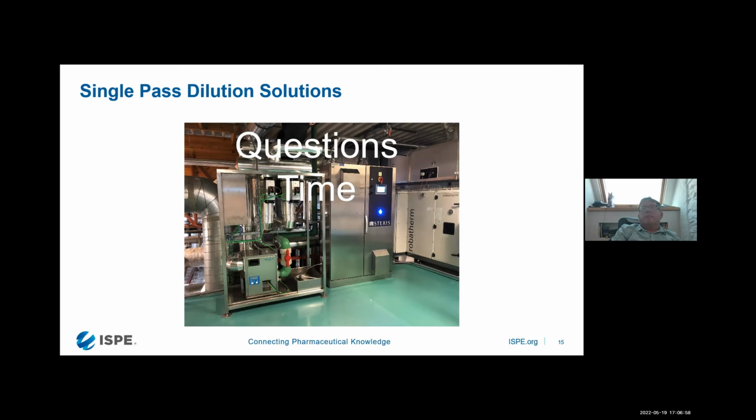Is there any chance that the H2O2 absorbed by the HEPA filter cannot be removed? No, well, the answer is a double no. The first no is that the H2O2 has, let's say, a short life. The H2O2 is a very unstable chemical form, so it will always degrade to water vapor and oxygen at some stage. That's the first no.